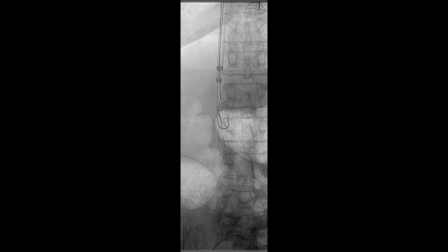The IVC filter was then hooked using the contracatheter between the struts and the neck, as opposed to under the struts, in order to avoid fracturing the filter. The filter was removed successfully through the retrieval sheath under fluoroscopic guidance using the hangman technique.